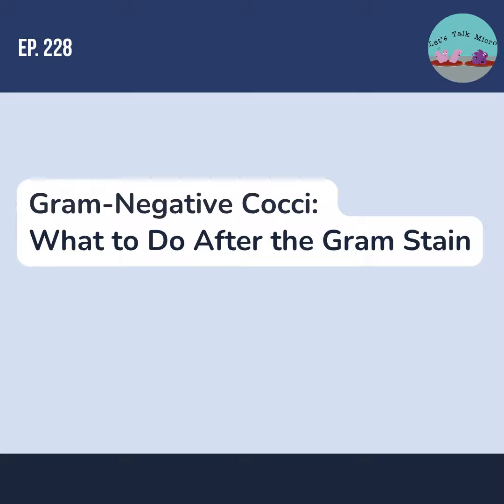And then you pull them out a few days later, you sub them again, and they still grow. But Neisseria gonorrhoeae is not like that. You take that plate out of the incubator and you put it in the fridge. You have a very short time before it dies. And I'm sure you know this if you work in a micro lab. Pretty much everyone has the Neisseria gonorrhoeae QC plate. You keep one in the incubator.